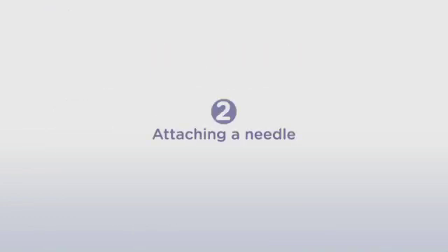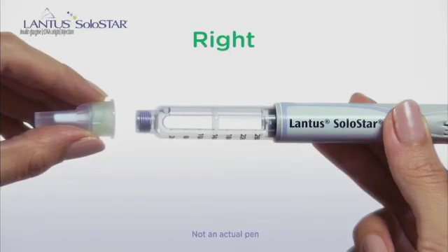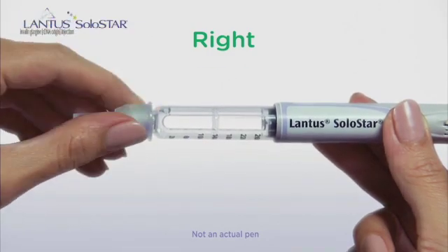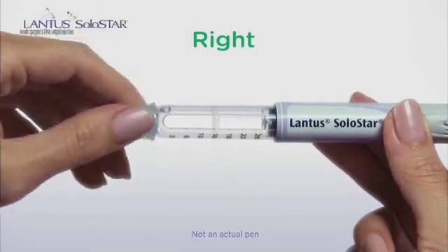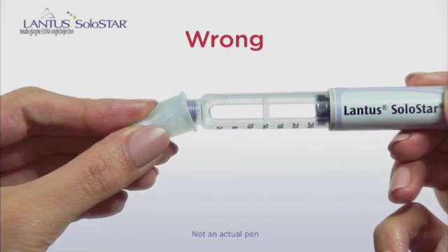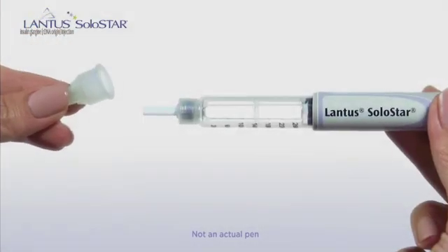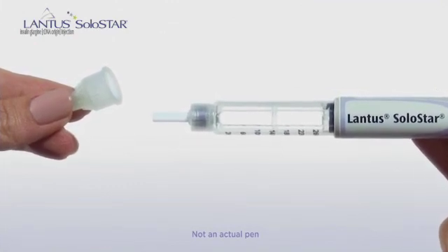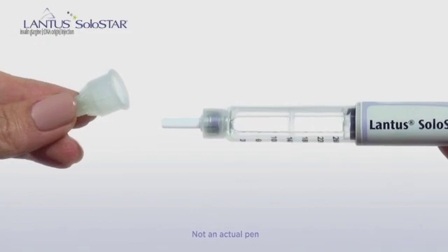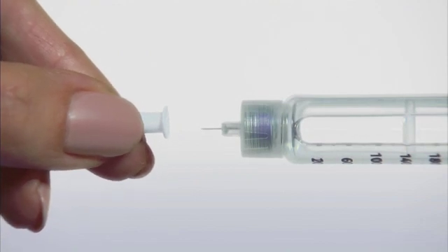Now you've completed the first step, so let's go on to Step 2, Attaching a Needle. First, remove the protective seal. Then, holding the needle straight, screw it on snugly, but don't make it too tight. If you have a push-on needle, keep it straight as you push it on. Never hold the needle at an angle when screwing it on to the pen. After you've attached the needle, take off the outer needle cap. Save the outer needle cap, because you will need it later to safely remove the needle after your injection. Now, take off the inner needle cap and throw it away.